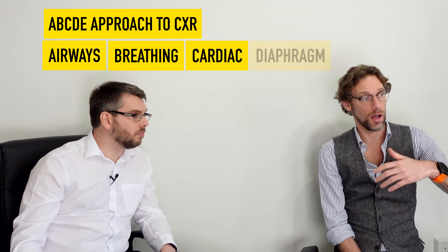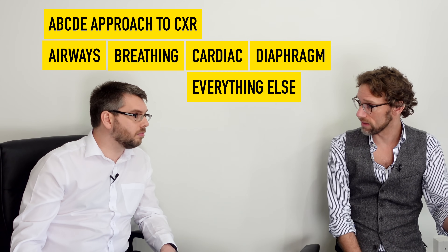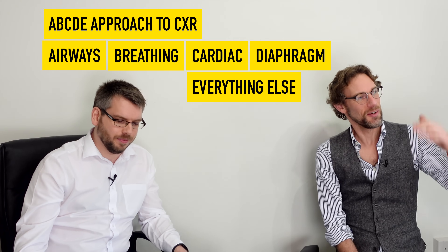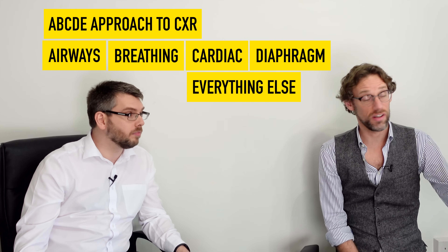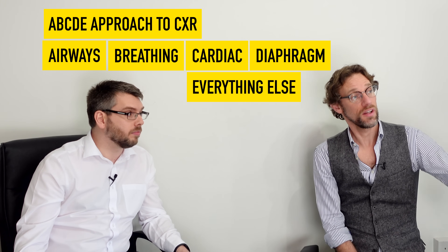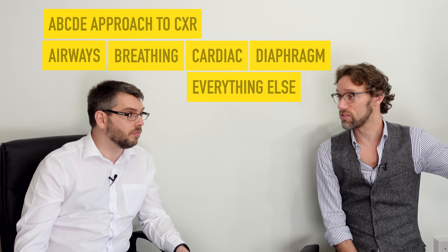That's described as walking around the chest. I've also seen an ABCDE approach: looking for Airways, Breathing, Cardiac, the Diaphragms, and then Everything else. With that in mind, let's walk around the chest X-ray. We'll start off looking at the apices and the lungs — and we don't say 'lung fields,' we only say 'fields' if there's a tractor in it.